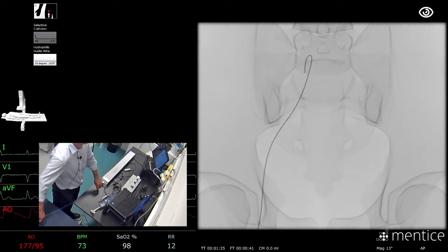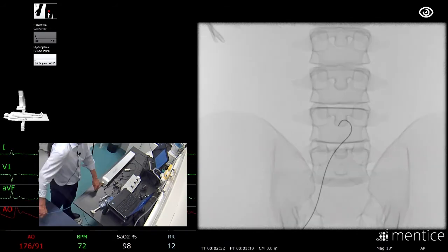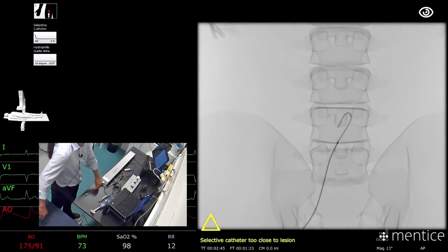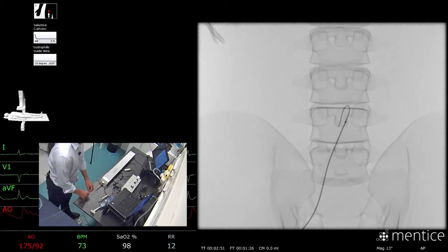Now at this stage we only know what we know from the CT angiogram. You can see there the catheter held up on a stenosis, and that's an indication of roughly where the stenosis is. The wire has transgressed the stenosis, and now I'm going to advance the multi-purpose catheter along the wire, being careful not to advance the catheter bareback, it's always traveling over the wire.